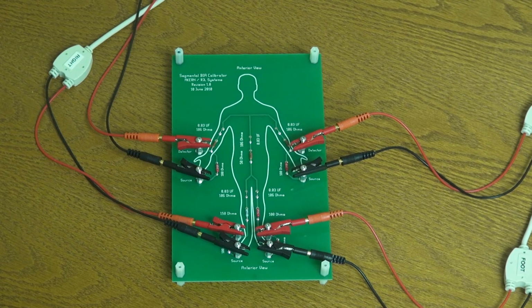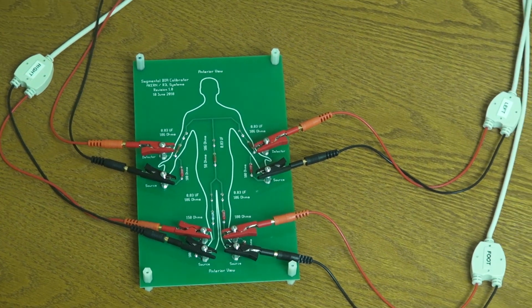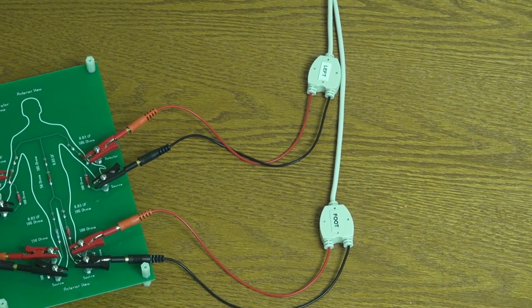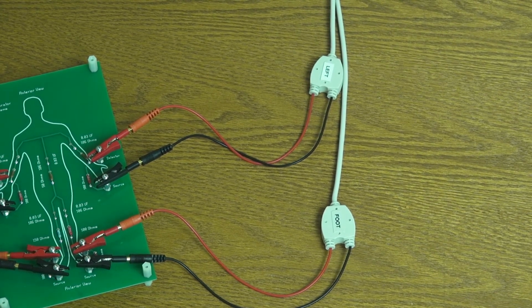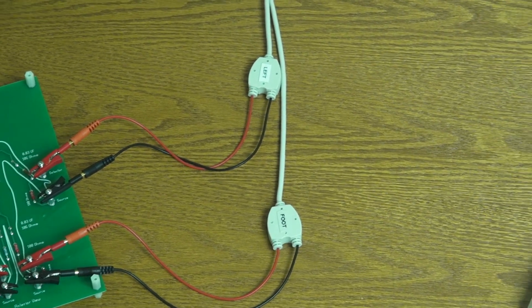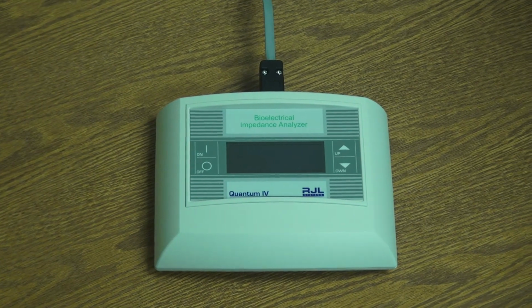Here is John Doe, the test frame that comes with the Segmental Q4. The leads are all labeled with which hand or foot they should be connected to. If you are testing a real person, you will want to use the disposable adhesive electrodes that come with the instrument and use the standard placement as shown on the electrode placement card.